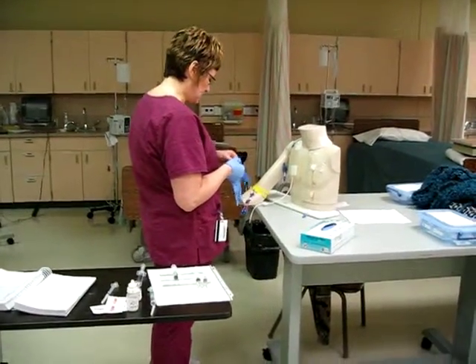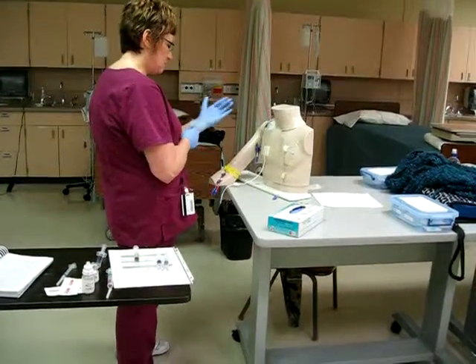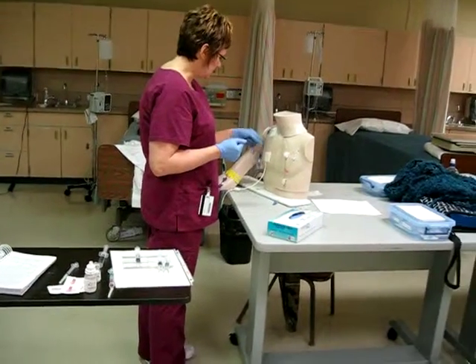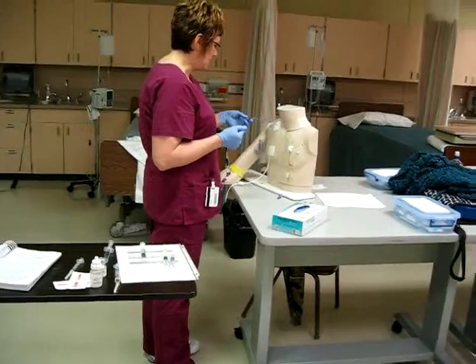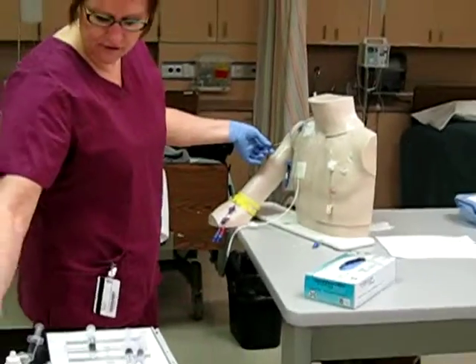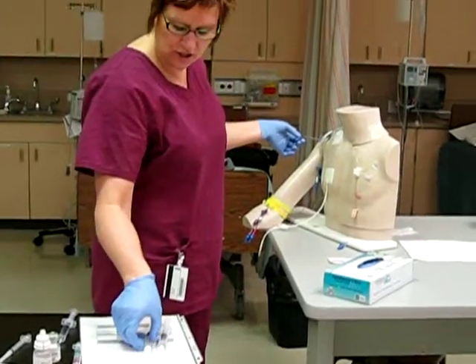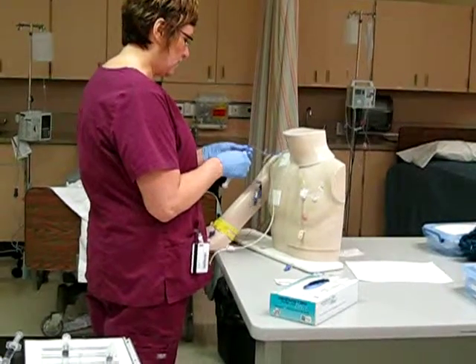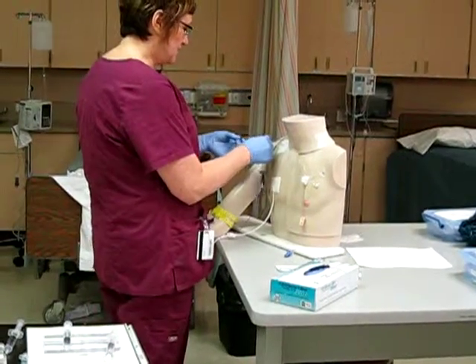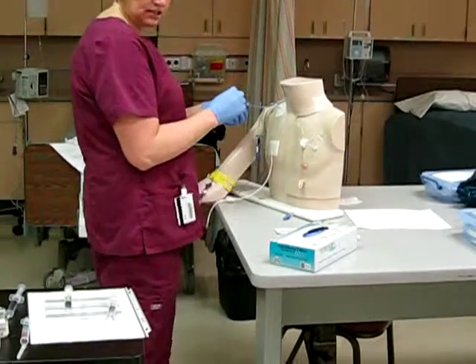I'm going to explain to the patient that I am giving him Dilaudid and a heparin flush, and I'm going to be giving the drug in the distal port. I'm going to clean off the port. I'm going to clamp it and then I'm going to flush with normal saline, keeping the pressure and reclamping when I have just a little bit left.